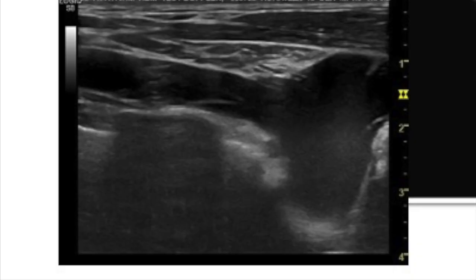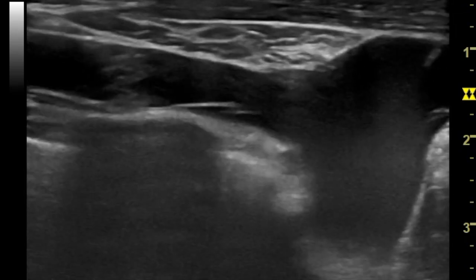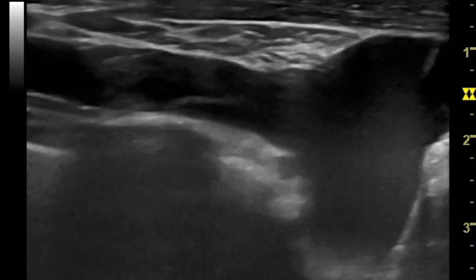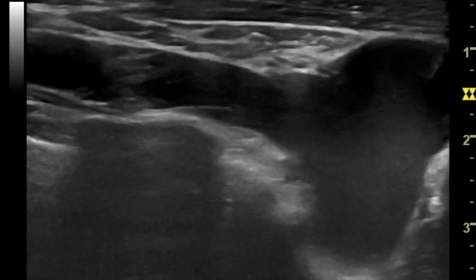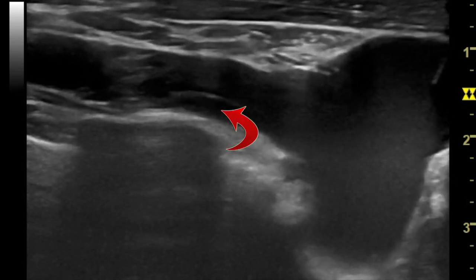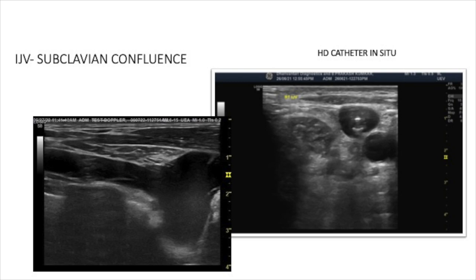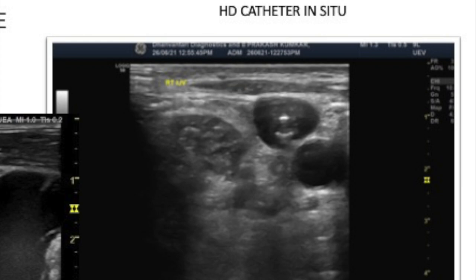In the deep veins, the internal jugular and the subclavian have a confluence at the root of the neck and form the brachiocephalic vein. This is a central brachiocephalic vein — you have the internal jugular and the subclavian vein — and you are almost always fortunate to see these typical venous valves. On your right is a figure where you have an HD catheter in the internal jugular vein, very commonly seen in patients who are on hemodialysis, especially through the central veins.